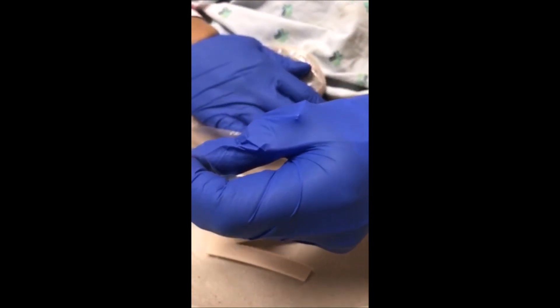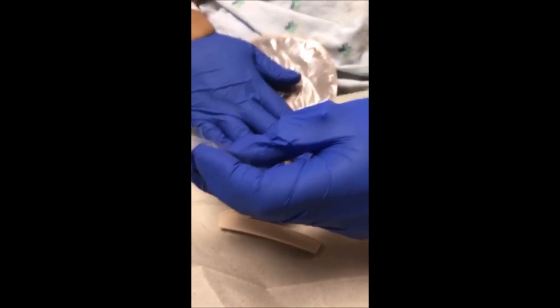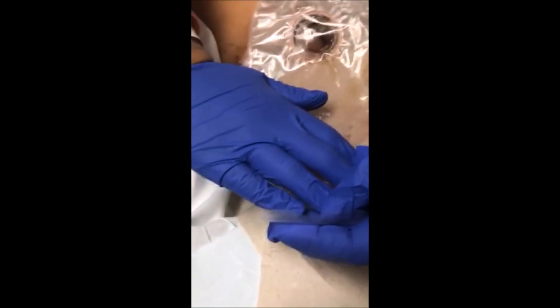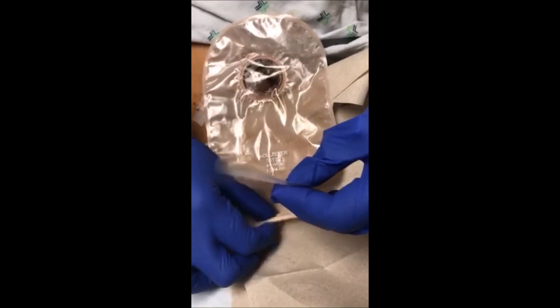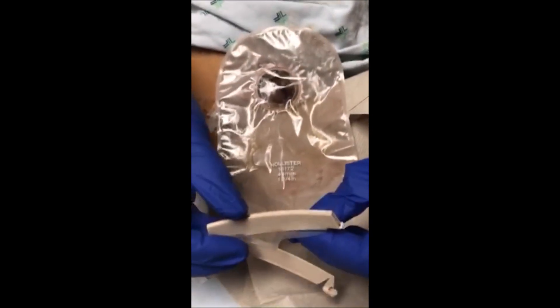There it goes — pushing it kind of from the top down out the bottom. It definitely smells like gas. And then I'm reclamping my colostomy bag to reclose it and secure it.